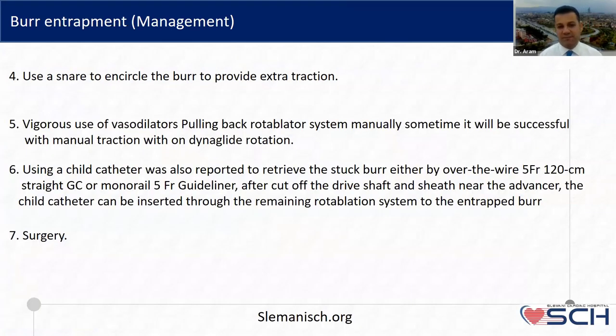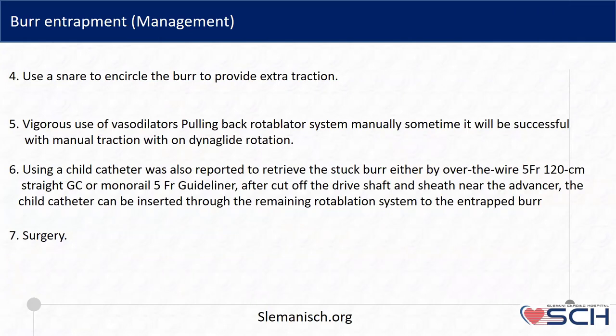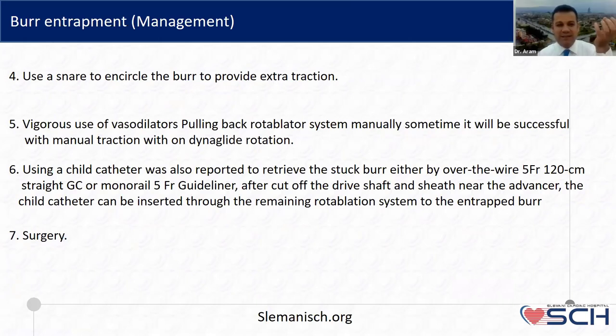Use of a snare, I think that this is just imagination. I don't think that when you have a stuck burr inside a heavily calcified coronary artery you can take a snare and take it out. It's mentioned in the literature, but I'm sure that it is useless, because imagine how you can retract this entrapped burr inside this heavily calcified vessel.